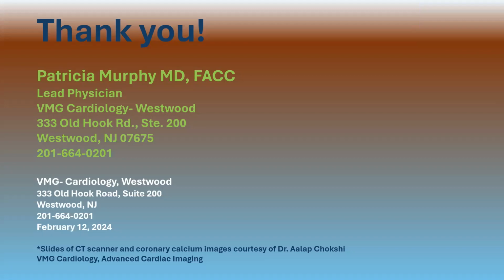Somebody had mentioned that they have a score that would rank as severe, with a family history. They're concerned that the score is not good, but might be a function of the type of plaque, hard or soft, in terms of underlying risk. So right, the score only sees the hard plaque, right? Only hard plaque. Okay.